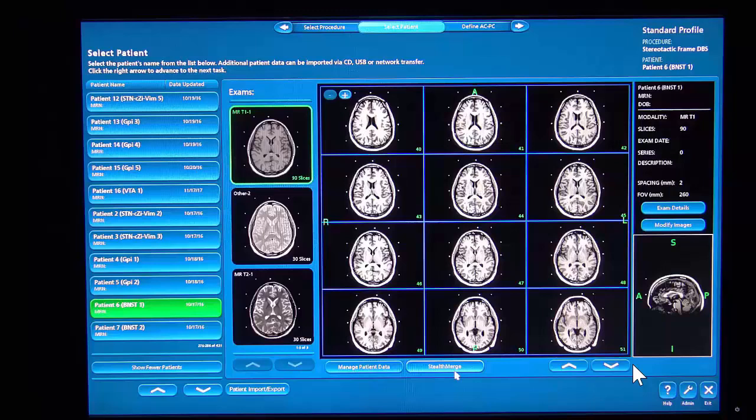I will now demonstrate targeting with a navigation system in a video. The targeting takes longer in reality, but this will give you a better understanding on how it is done. However, in order to learn how to do it, please consult the lecture dedicated to targeting with a navigation system.